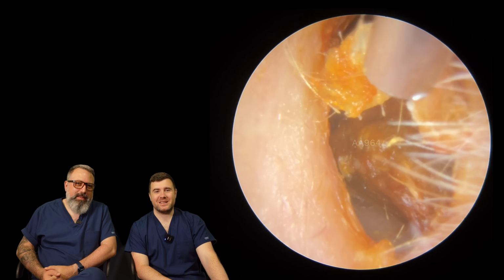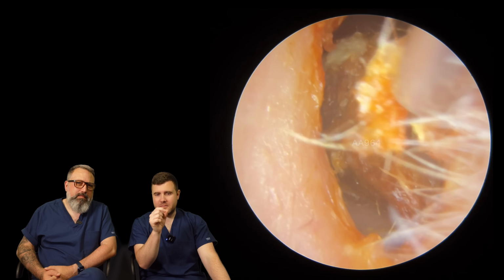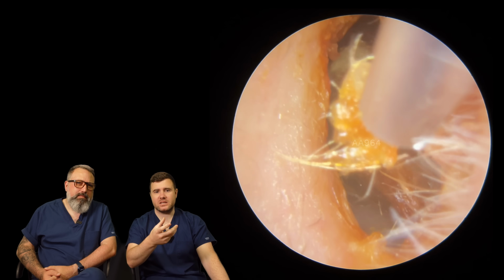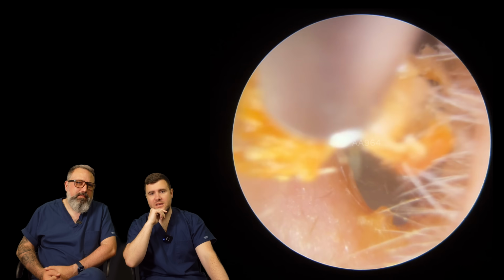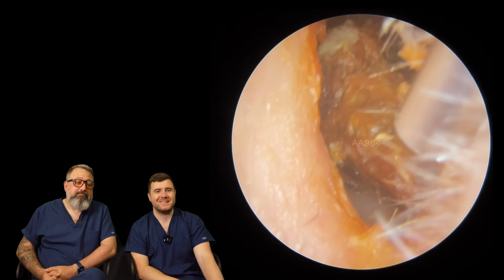But yeah, I think this is the fine end. Tend to find with these little thin pieces of skin with the standard size tube, they tend to whistle quite a lot, which is called clarinetting. If it's your first time watching the videos.